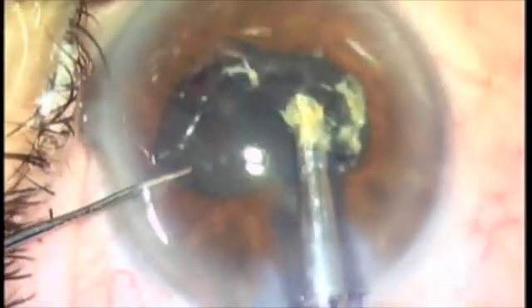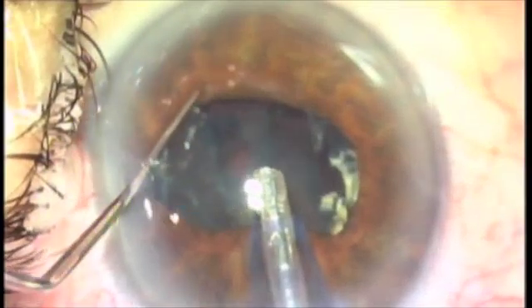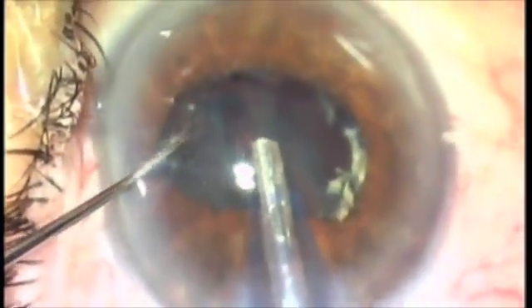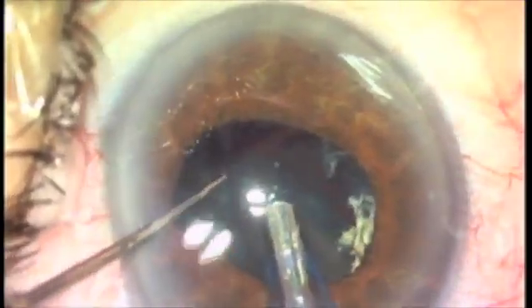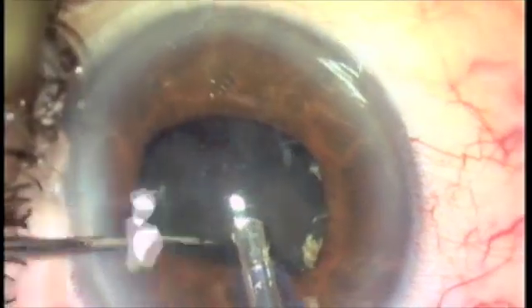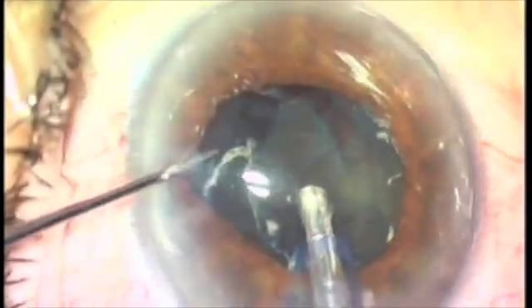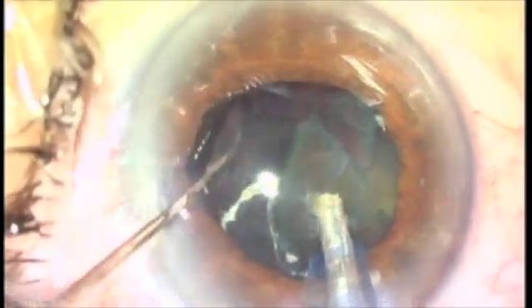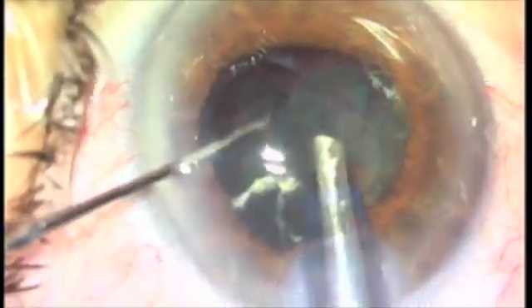Again, I'm manipulating that nucleus, putting the portion that I want to nibble away at right towards the center of the pupil. At this point I could inject a little more viscoelastic, which is slowly being sucked out of the eye behind the nucleus to raise it up in the iris plane.